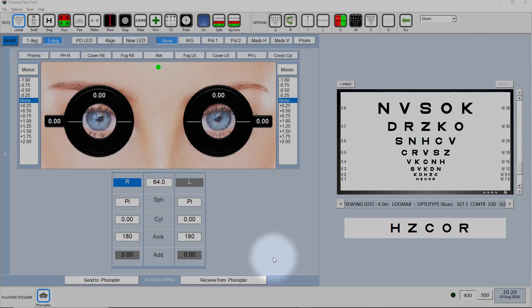So the first thing you have to do is make sure that both your patient management system and the Phoropter interface are pointing at the same import export file.